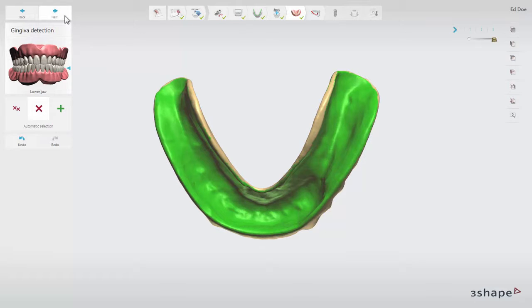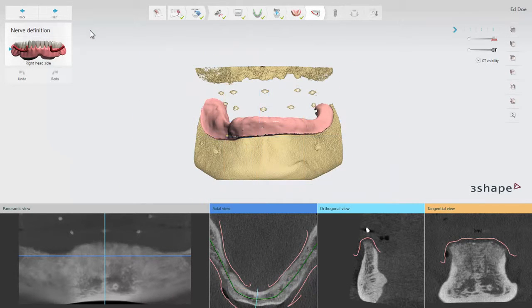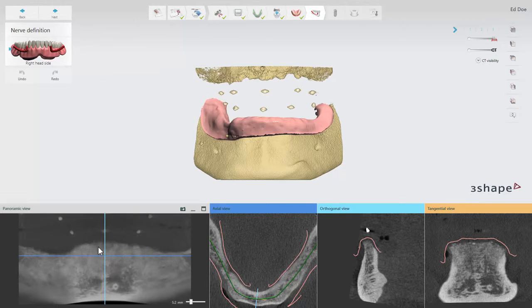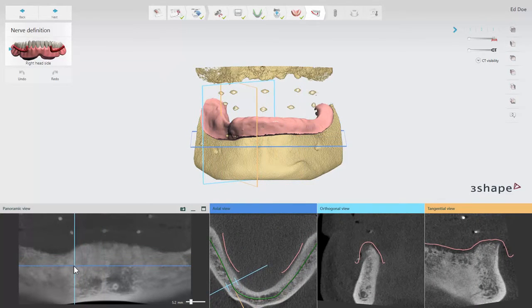Click Next to move to the next step. At the Nerve Definition step, you have to define the position of the mandibular nerve canal. In our example, we will only show the right nerve canal definition. Remember that for the left nerve canal, the same action should be performed.